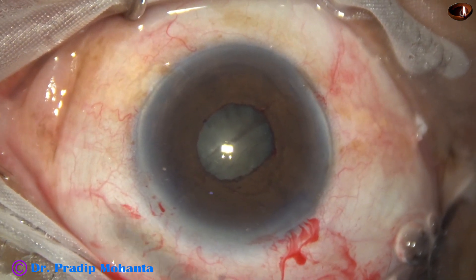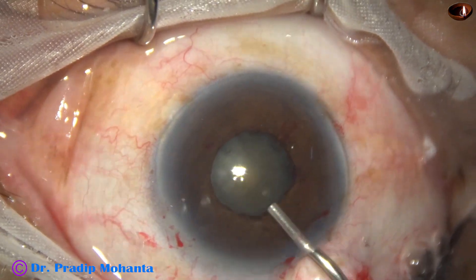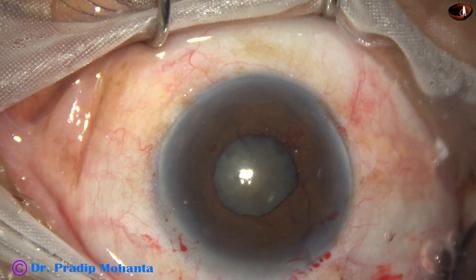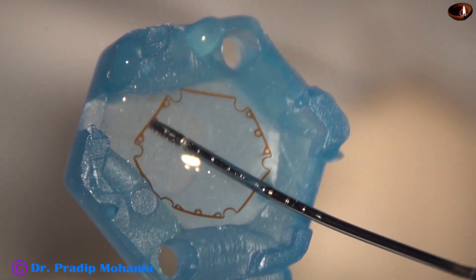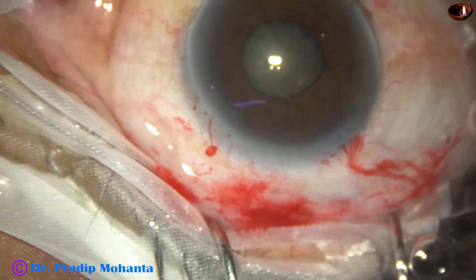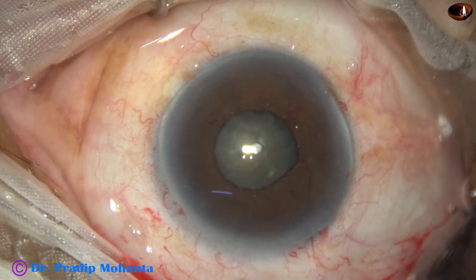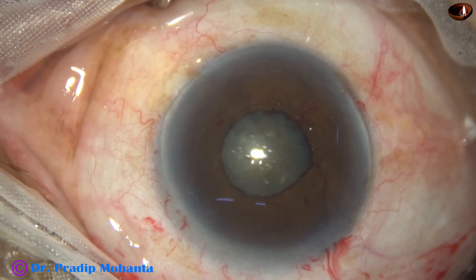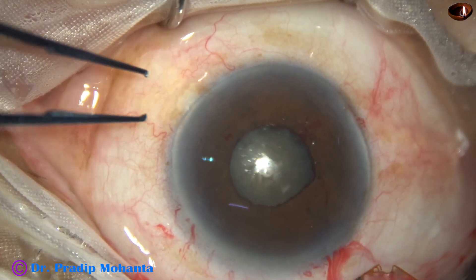This is a controlled tear of the sphincter. B-Hex is a very flexible device and to get a good effect we have to use this technique — controlled pupillary stress — so that B-Hex can act and we get an optimum-sized pupil.